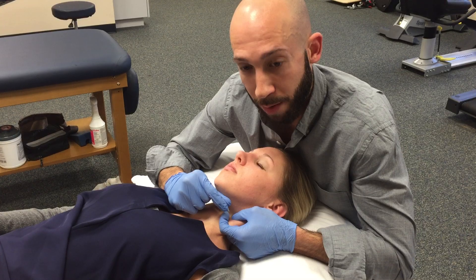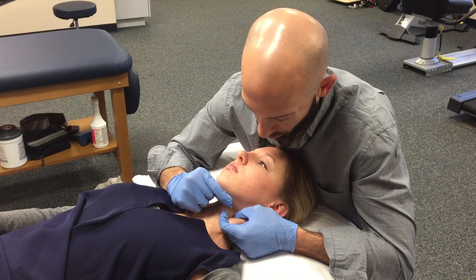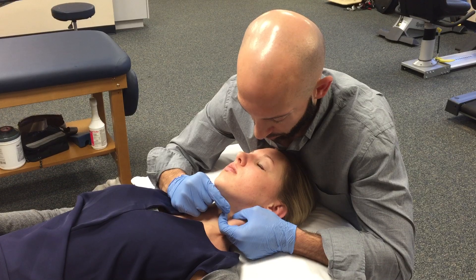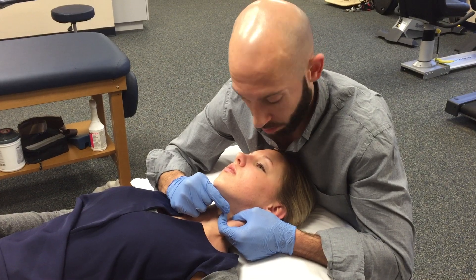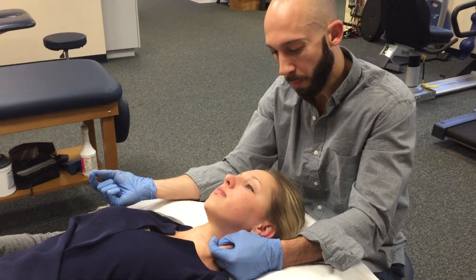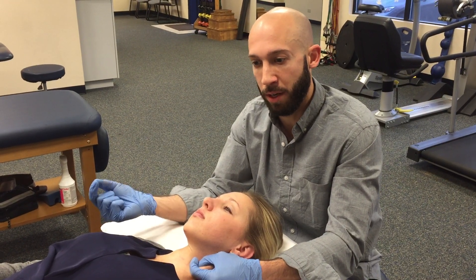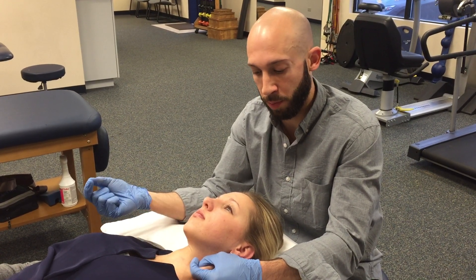If you get that twitch response, you can stop for a second, reposition, repalpate, and find that trigger point again. You can angle your needle toward that trigger point. I'm going to needle until that twitch response fatigues. Once it's done, I'll come out and apply hemostasis. When you needle, your objective is to elicit that twitch response — that's a spinal cord reflex, and it's been identified as necessary in order to relax that trigger point. So I'm going to needle until that twitch response stops.